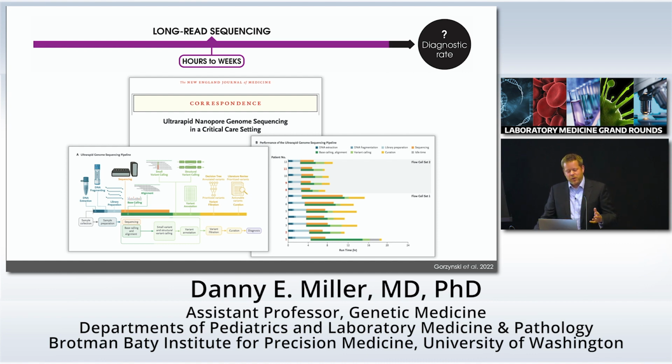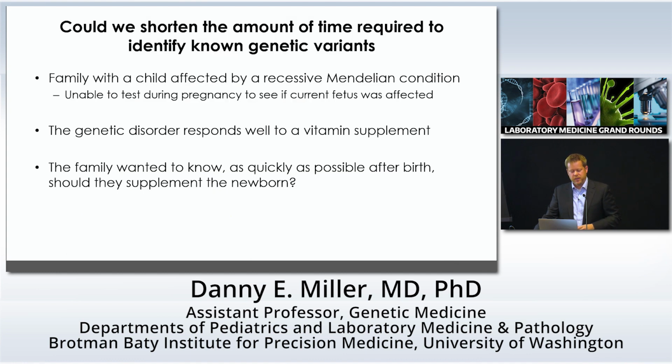So, our question was, given this workflow, and this is something that we had talked about doing for quite a while, we thought, could we actually do this, first off, quicker, but also, second, using less blood? Because in the populations that we're thinking about, in neonates, you don't really want to start with 3 to 5 mils of blood. You want to start with less, because there's daily blood draw limits, things like that.